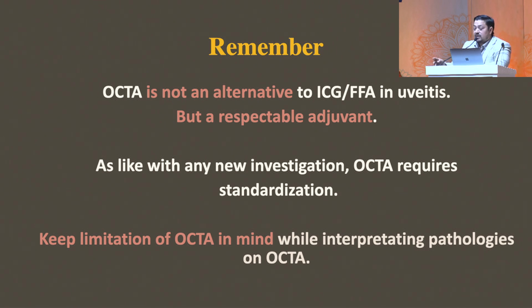As with any new investigation, OCTA requires standardization. Keep the limitations of OCTA in mind while interpreting the pathologies on OCTA.